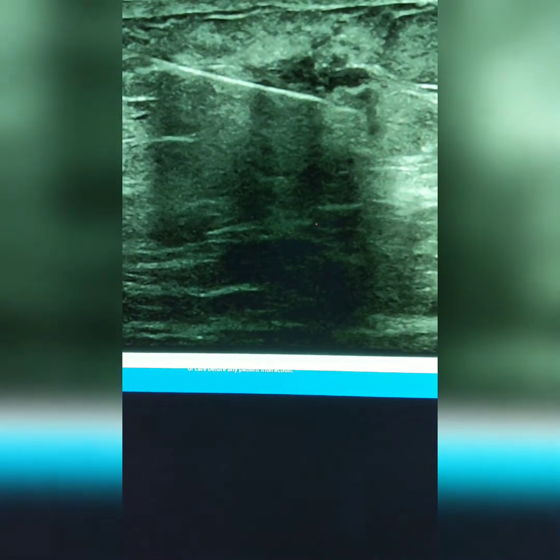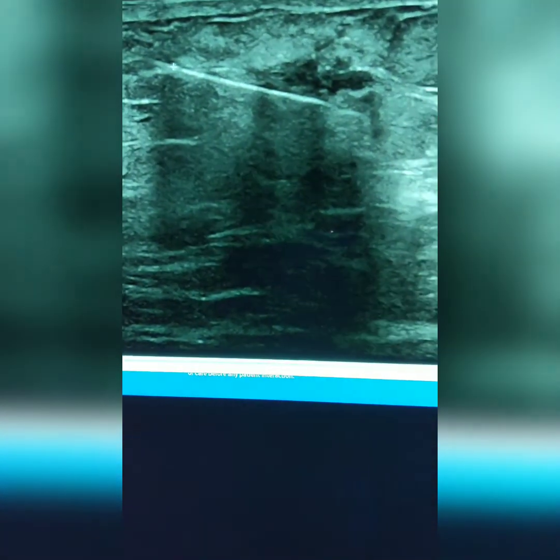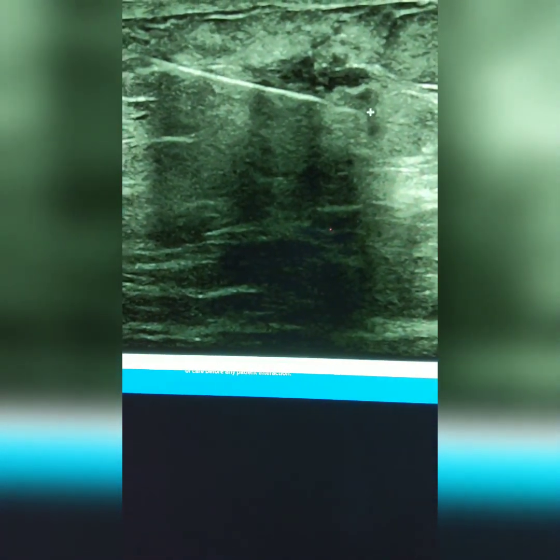So as a radiologist, I do an image-guided, ultrasound-guided biopsy of this lesion. So this is my needle. It's coming slanting in from the skin surface up at the top here, and you can see it's going through the middle of the mass, and this is my first pass through it. It reaches out like a little jab into the mass, and it grabs a little piece of the tissue. And I took 3 of these, and then we send it off to the pathology lab, and we find out what it is afterwards.